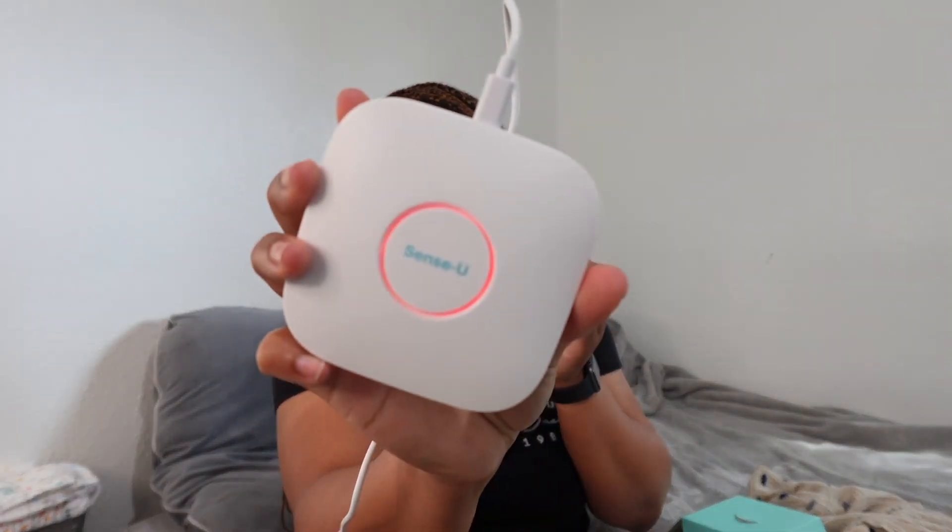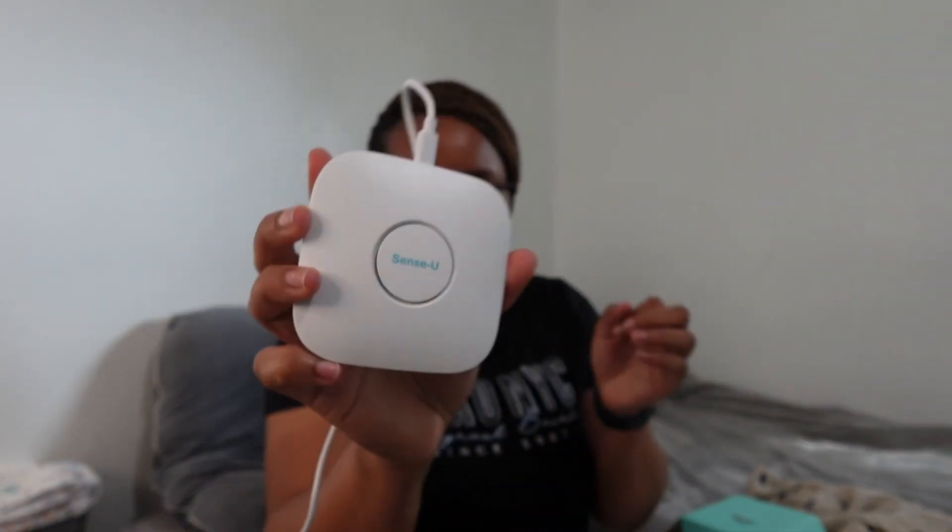Let me read the manual so I can understand how to connect it to my phone — let's connect it together. So let's set it up: plug this in and plug it in. You have to plug this in first. Okay, so it is turned on — you can see it's showing different colors.